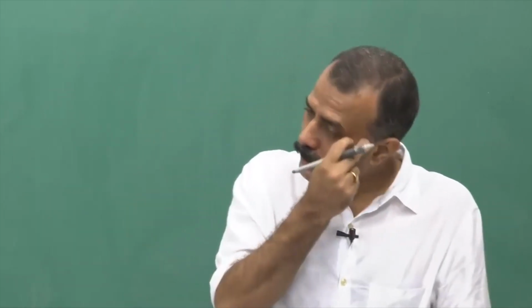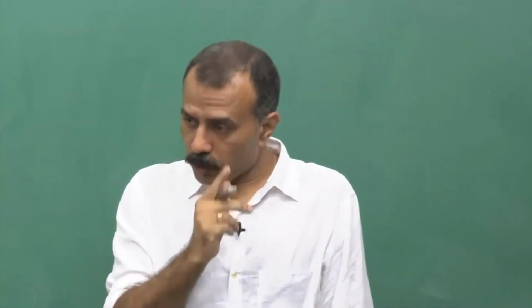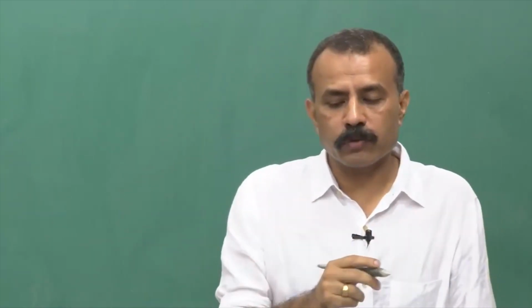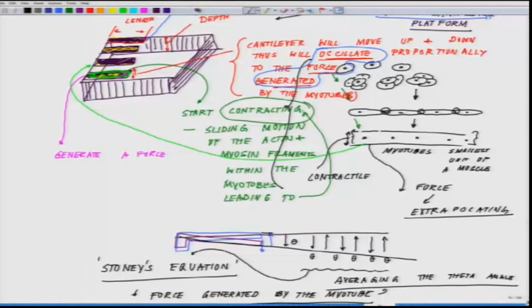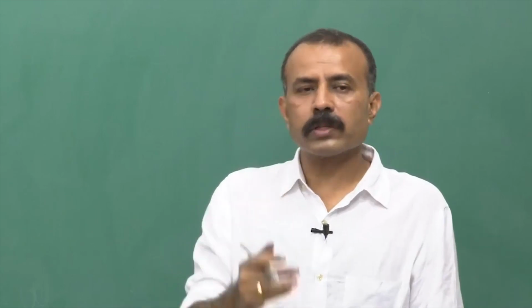Now, having said this, this is not such an easy technology. You have to realize that while you make a well like this, there is a very limited amount of medium which can be placed there, and that needs a lot of optimization, a lot of process which has to take place.